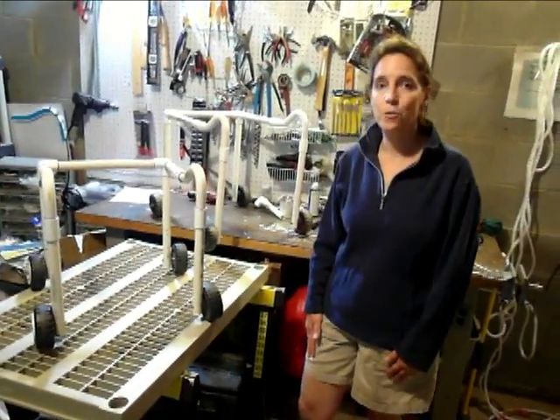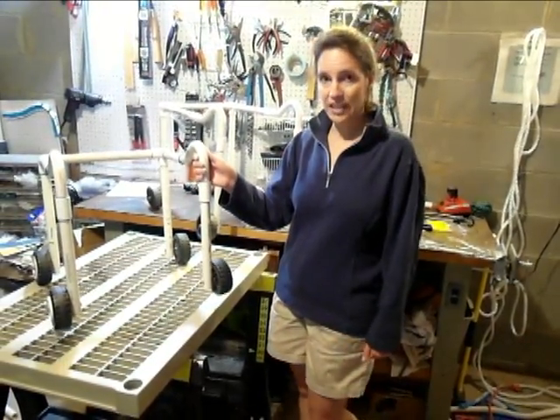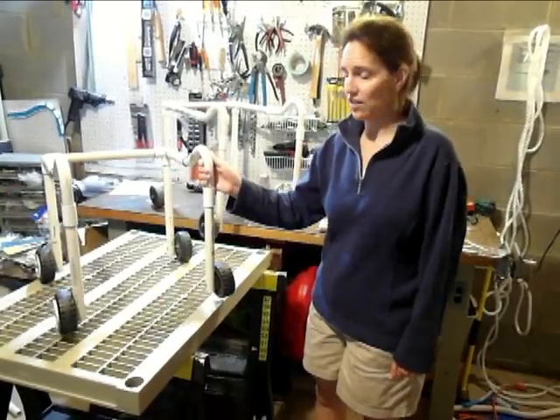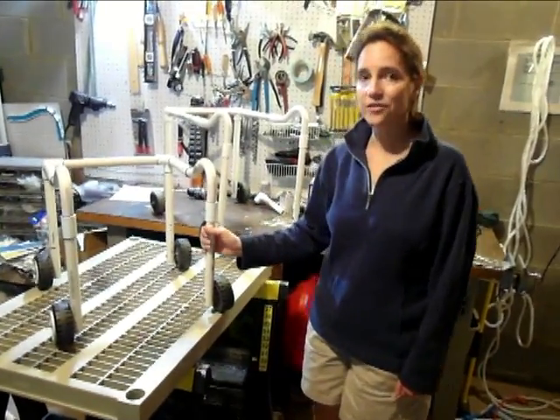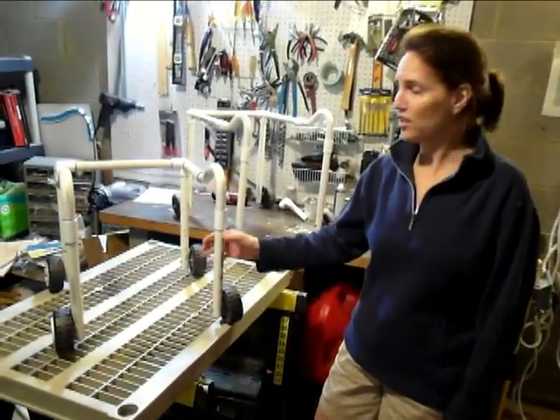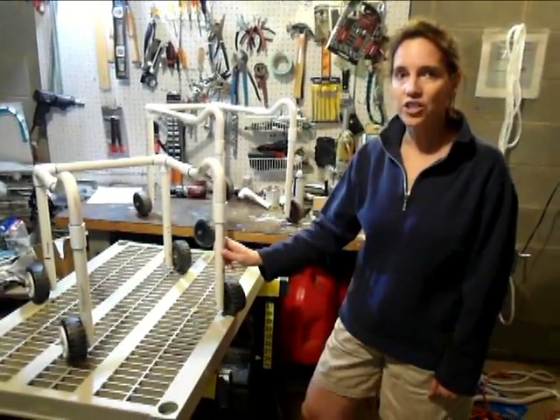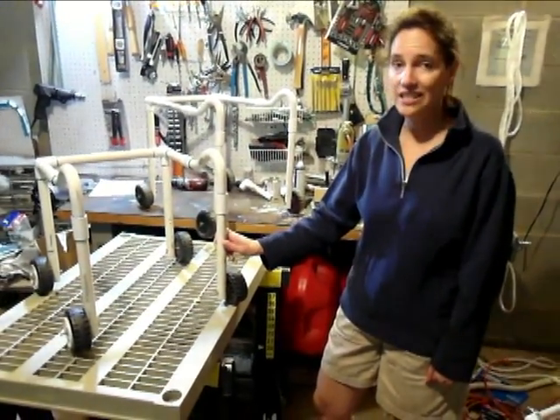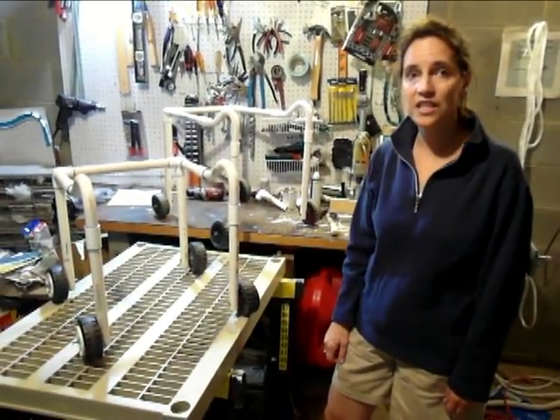We were going to go to the beach one year, and I wanted him to have a walker to use, and I thought of an idea of using PVC pipe to build him a walker. It turns out that the walker was good not just for the beach, but for everywhere — it's so lightweight. I'd like to show you all how to build a walker, too, and it's very easy and very inexpensive. You can build one of these for about $15.